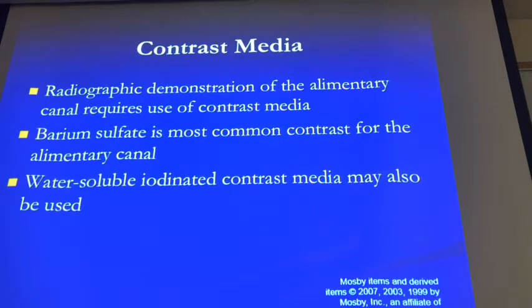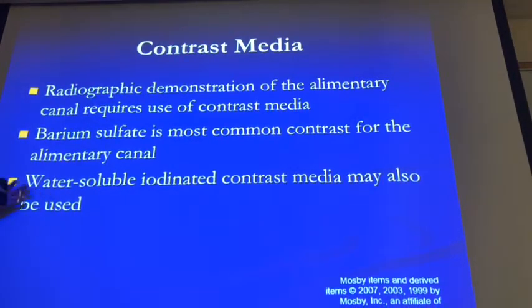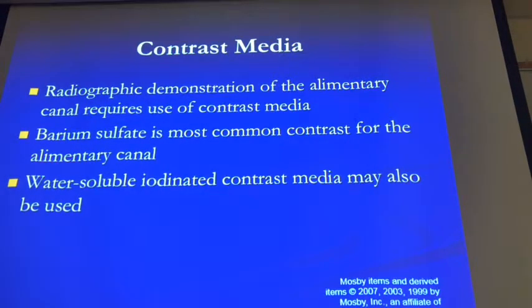Remember when we studied the abdomen, I said, look, this is free air. That's what free air was telling us, right? A lot of times you don't see free air. If you see free air, then you know the patient has a perforated bowel. You leave it at that, and then you try to find out where it is. If you don't know, then they might move on to an exam like this and see what happens, if a perforation exists.